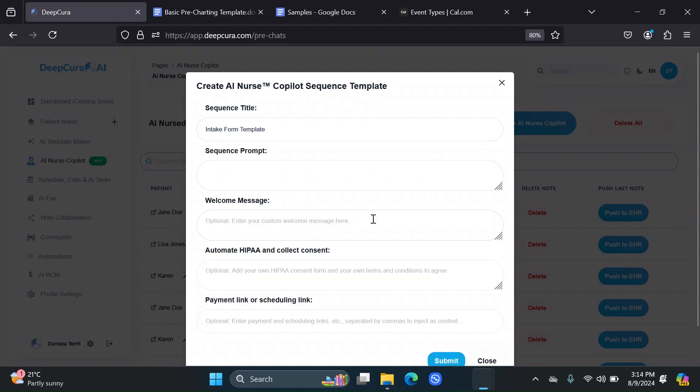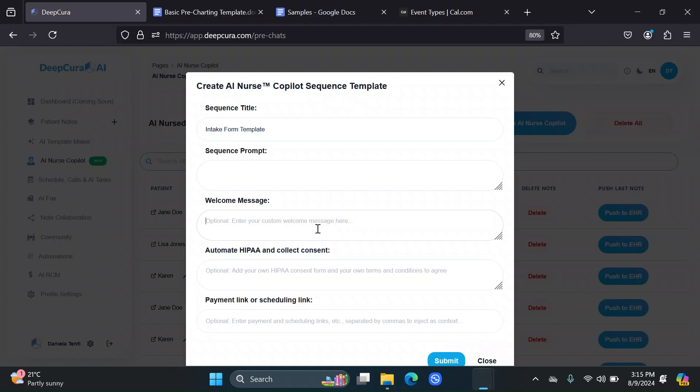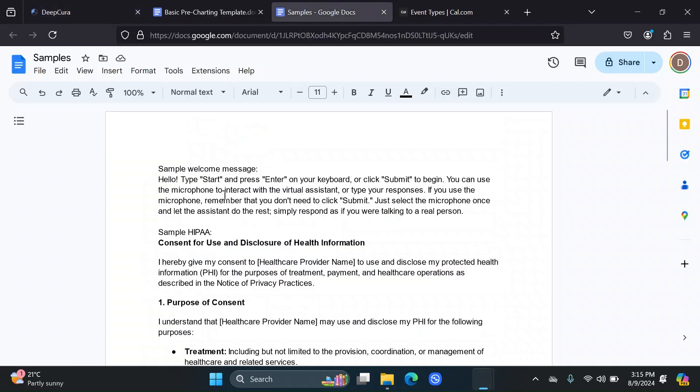Then you get the option for a welcome message. What welcome message are we talking about? When your patient opens the AI nurse interaction, the AI nurse welcomes them with a message. This message, we have a default one, but you can also customize it to something you would like. So maybe one option I would recommend is something like this sample message.